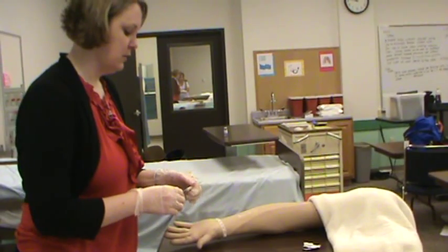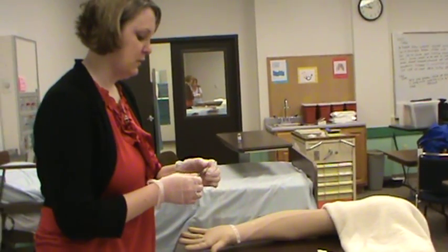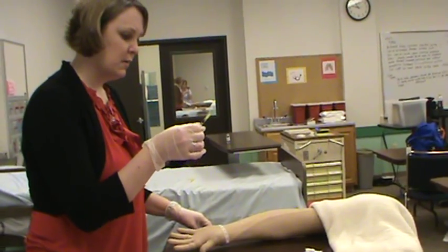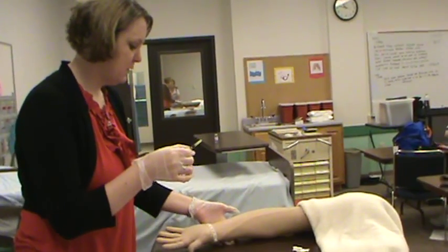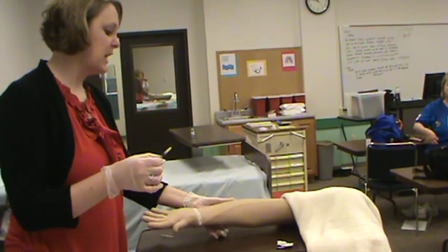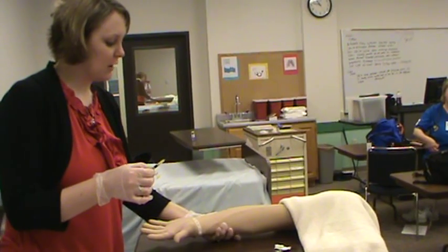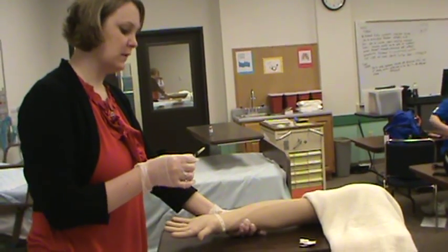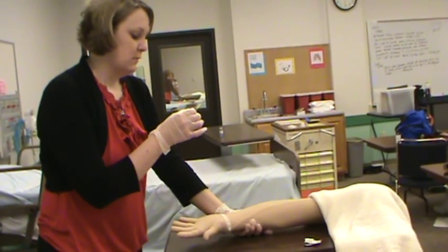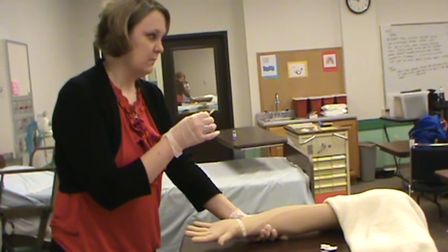Pick up syringe, holding it between thumb and fingers. So I'm going to hold it between my thumb and fingers just like so. With the other hand, stabilize the arm and stretch the skin on the forearm. It works best if you take your non-dominant hand and grab underneath of the patient's arm and pull tight so that their skin's taut. Place the needle bevel up almost flat against the skin so that the tip of the needle can be seen through the skin.